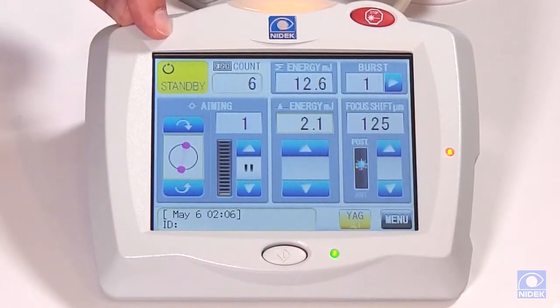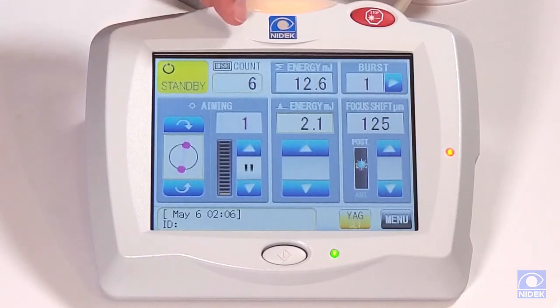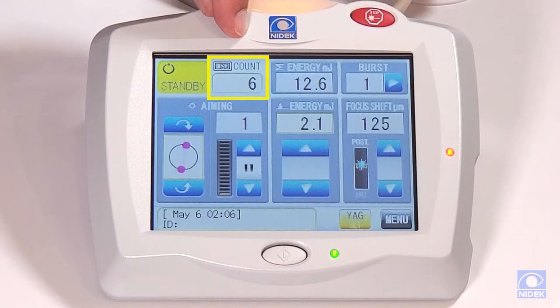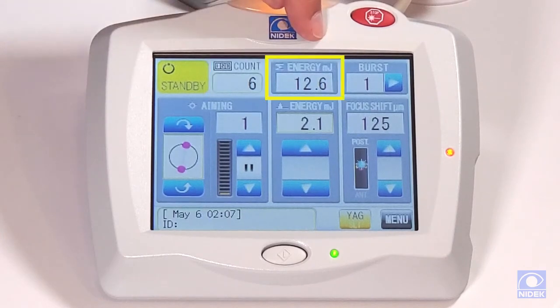I'm going to come up to the top left corner to see your standby tab. By pressing that, you can go into ready mode and start your treatment. This is your counter on how many laser spots that you've treated, and the total amount of energy used.